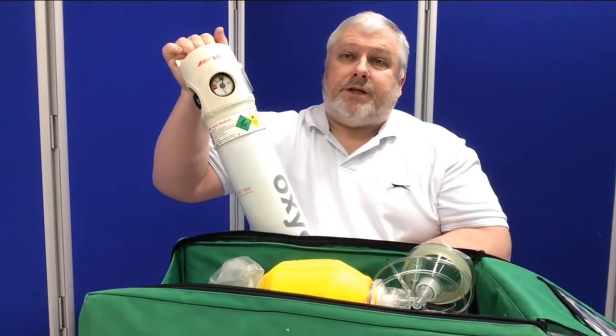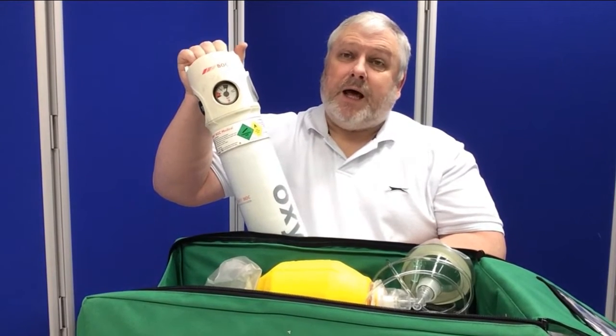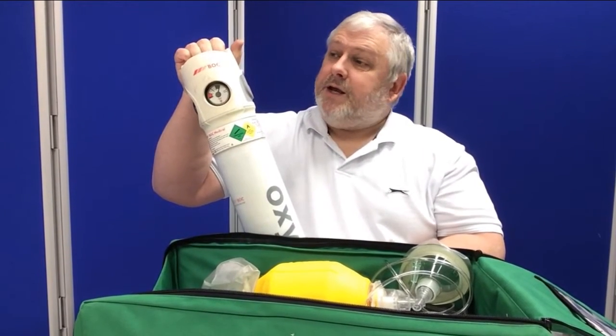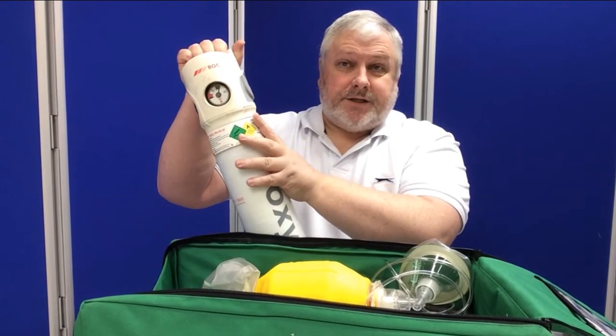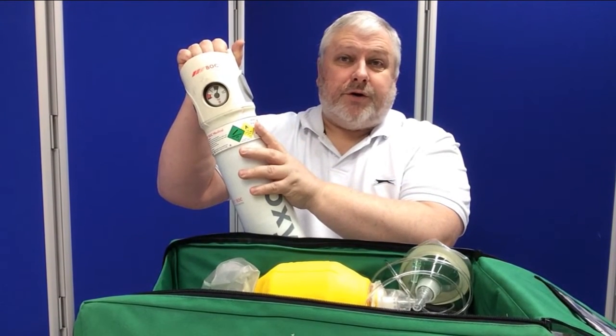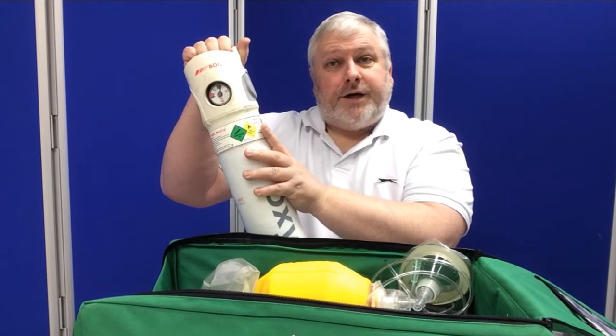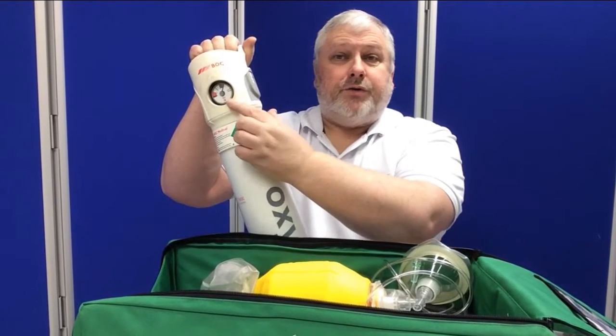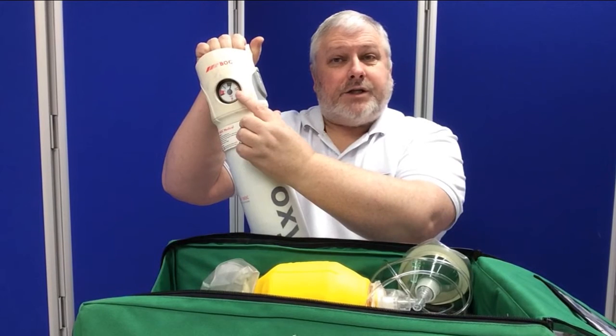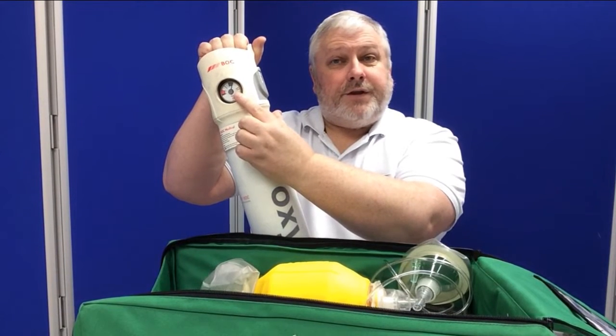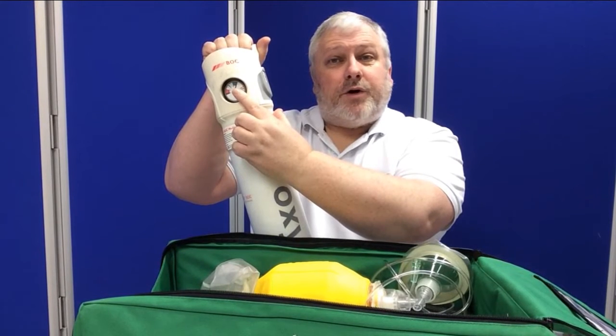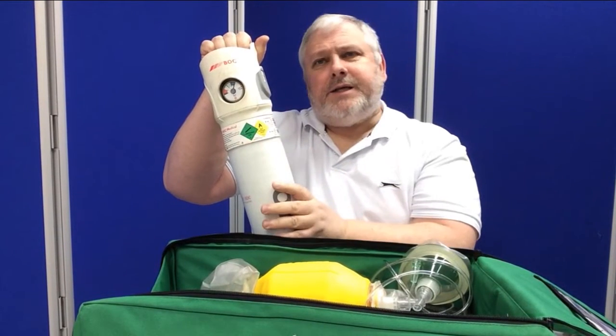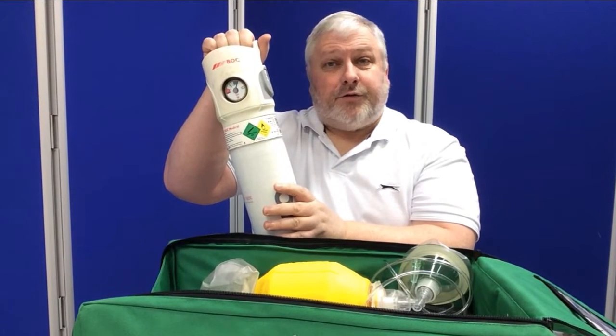This particular cylinder has what is known as a live gauge. That means it will always show how much oxygen is in the cylinder, whether switched on or not. Therefore, in order to check this type, all you need to do is look at the gauge. As long as it's in the green, everything is fine. Once it hits the white, that's three quarters full and downwards, it's time to start thinking about getting it replaced.